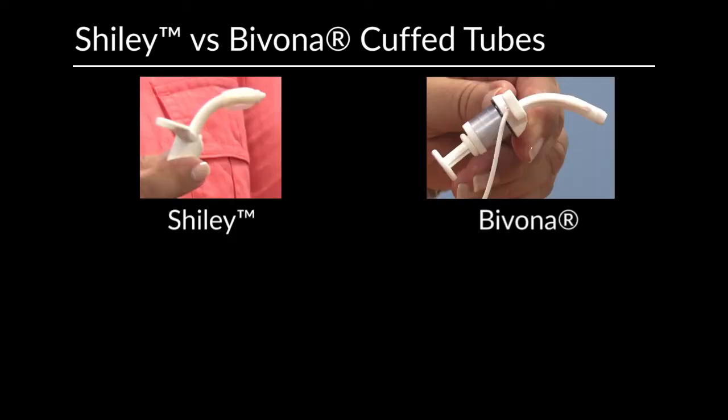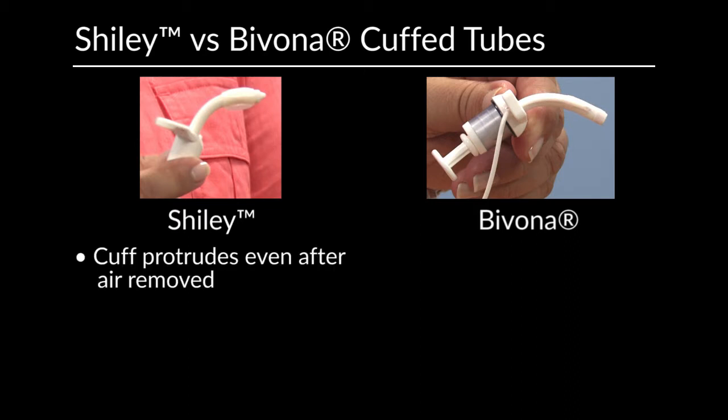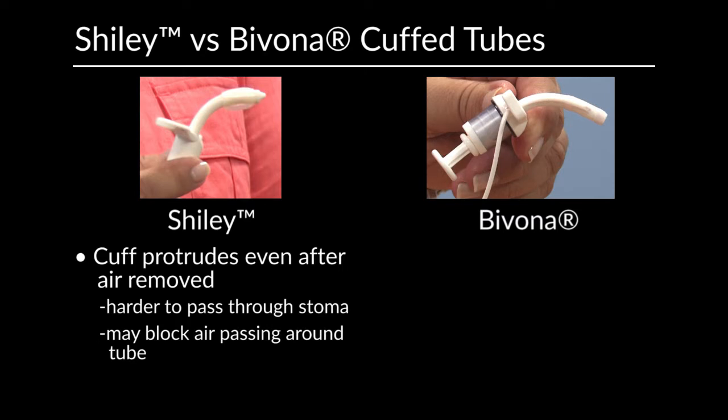Comparing the Shiley and Bivona with cuffs, the Shiley, you can see that the cuff is still protruding even though the air has been removed. So in some cases it may be a little bit more difficult to pass through the stoma. In addition, when it's in the airway, if the child can pass air around the cuff and is allowed to speak or use a speaking valve, then this is an area that may block some of the air coming out up through the nose and mouth and may make it a little more difficult to talk. It's very individual. Certainly please discuss this with your provider.